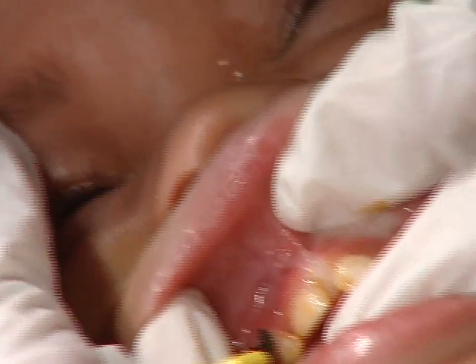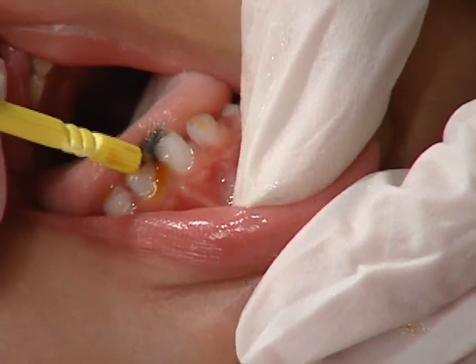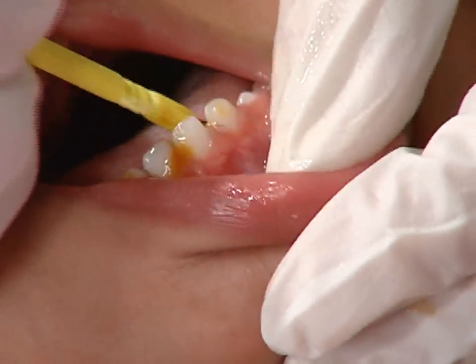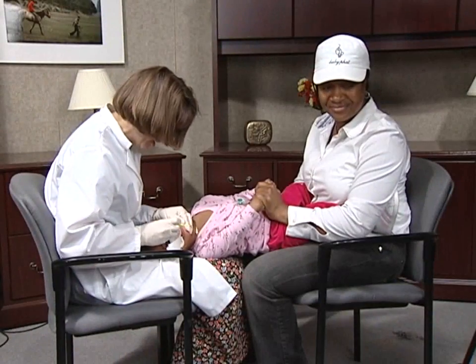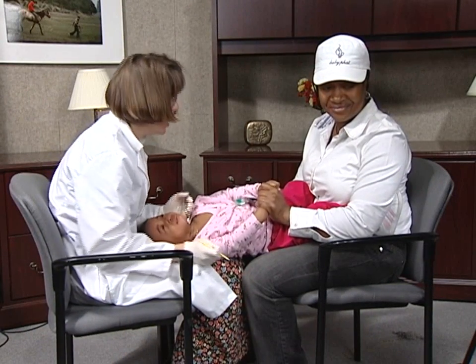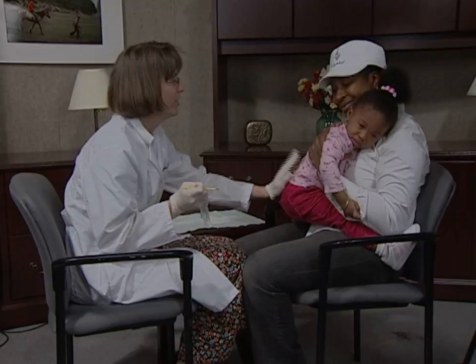We're using cavity shield varnish here. Young children often cry when this is done, but this means their mouths will be nice and wide open. Now dry and paint the bottom teeth — it would be helpful to use your finger to keep that tongue out of the way. When finished, clean her face and sit her up.